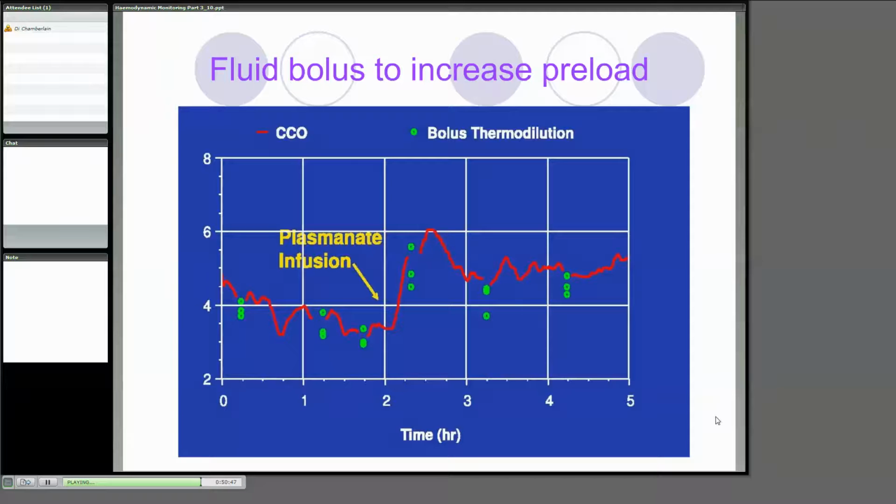Okay, so that's in the real world. We've got to look at it. But if we had a single pulmonary artery catheter or even a central line, and some countries can't afford even that for their patients. Their shock patients are managed purely on clinical presentation. But okay, so we've got cardiac output there, time across there on the x-axis.